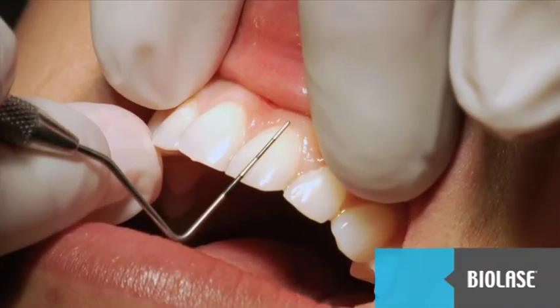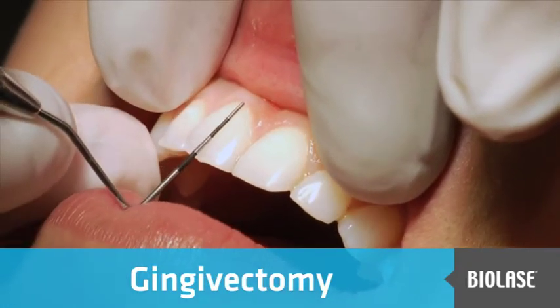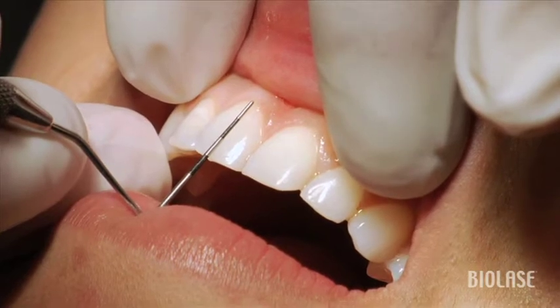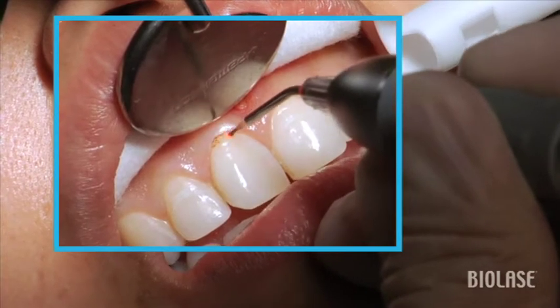A very common anomaly, especially among females, is that teeth number 8 and 9 are often asymmetrical, and in this case we see that tooth number 8 is about a millimeter shorter than tooth number 9. So we're going to use the iLase in the gingivectomy setting in order to correct this situation.